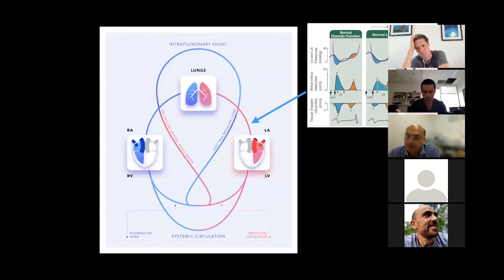When we talk about the A wave, it depends on the sinus rhythm. If the patient is very tachycardic or there's atrial fibrillation, which is very common in the sepsis or the ICU category of patients. Can you give me problems with the TDI now? Yeah, again, it depends on, say, the patient's got mitral valve disease, and annular calcification will affect it, and regional wall motion abnormalities. All these measures will affect the E to E prime.